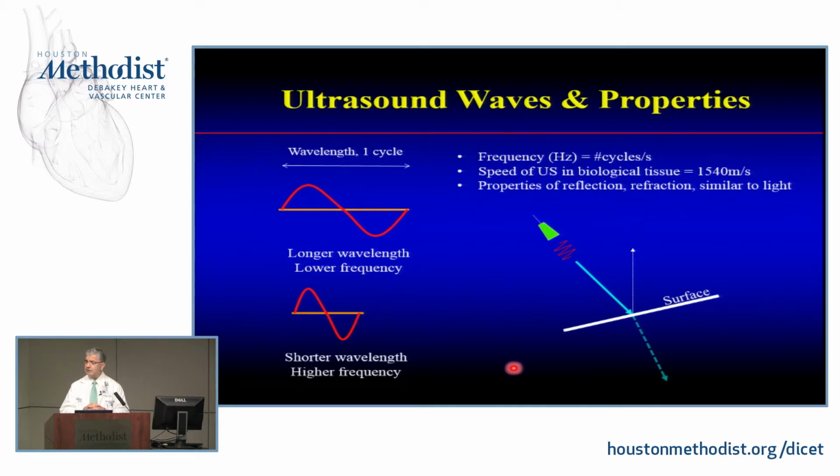Now you can say to yourself, how can all this wave be going away? I'm not registering anything that comes back. Why? For you to be able to see an image or solve the equation of this ultrasound coming back to you, it's going to come back to the transducer itself. And what you see in little red, and I put it deliberately in thin, is that a very tiny fraction of what you send will come back to you. A very tiny fraction, okay?